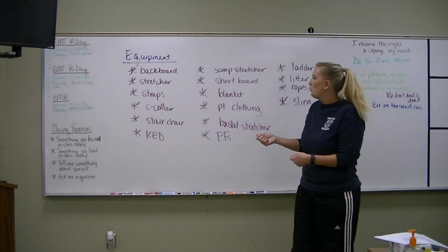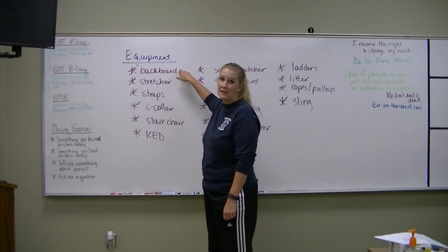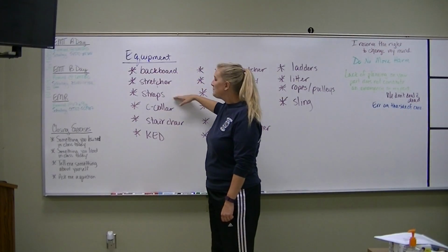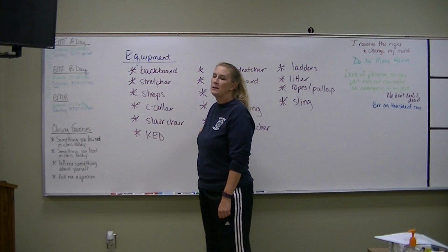Right? So when we use a backboard, do we use it independently? We did in class today, right? But we don't when we're dealing with a patient. Do we use the straps independently? Maybe. Yeah. How are we going to use them independently?